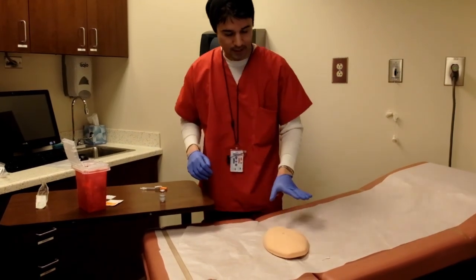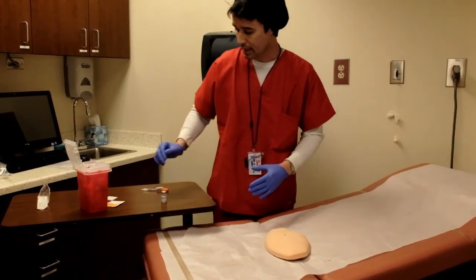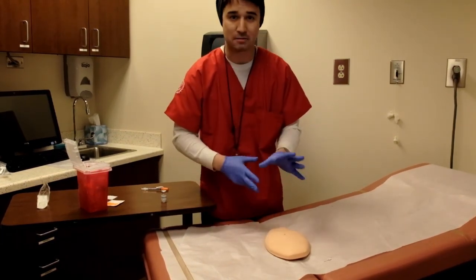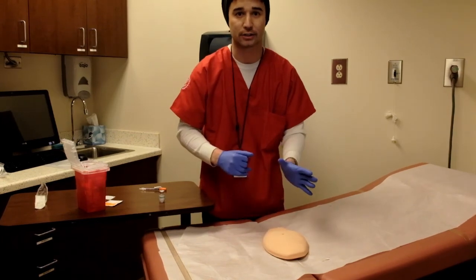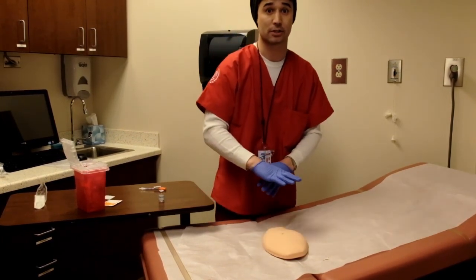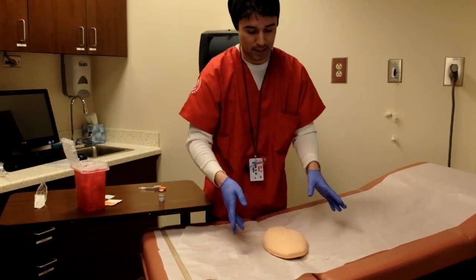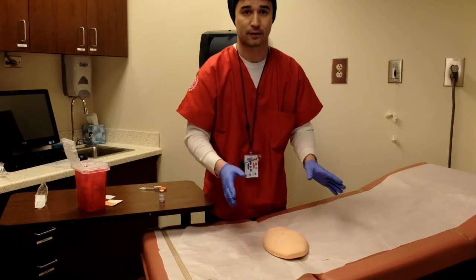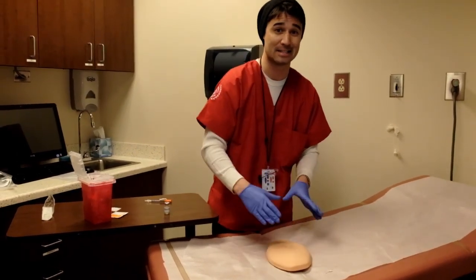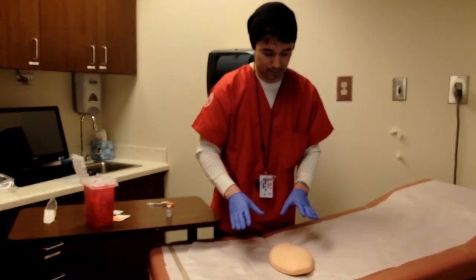So we'll look at the abdominal area that we're going to give our sub-Q injection into. And we'll assess for any scarring, bruises, rashes, those kinds of things. We want to avoid those areas. We don't want to cause any extra damage to the skin in that area. We also want to be around 1 or 2 inches further out in circumference from the belly button area. We don't want to be giving any medications into the belly button. It would be a bad day right there.